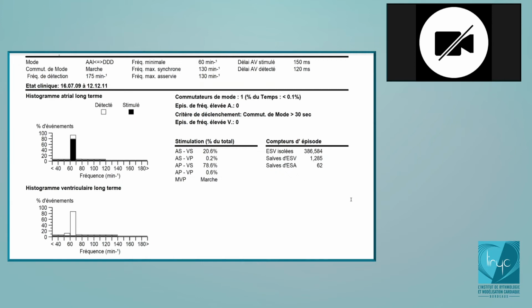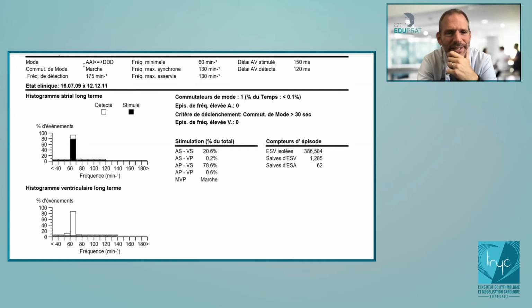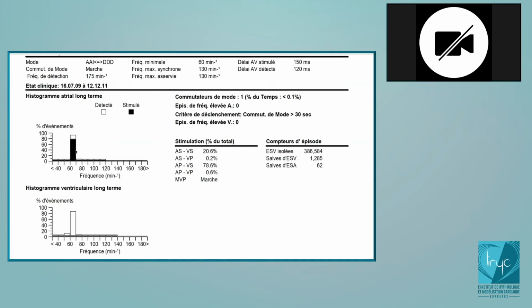I understand what is going on, but how to say it in English? The patient heart rate is programmed AAI DDD MVP, without rate adaptive response. Yes, and this is the problem because the heart rhythm of the patient does not increase with the effort.